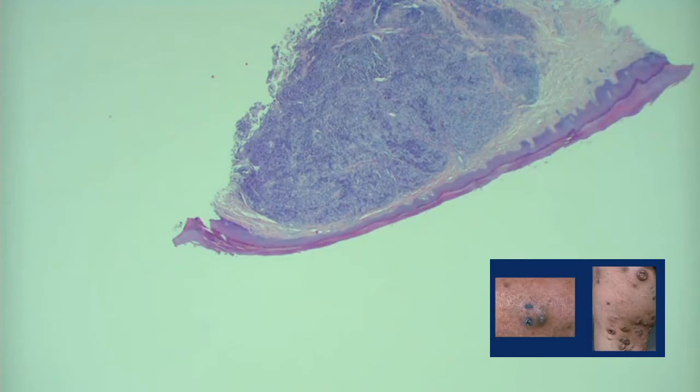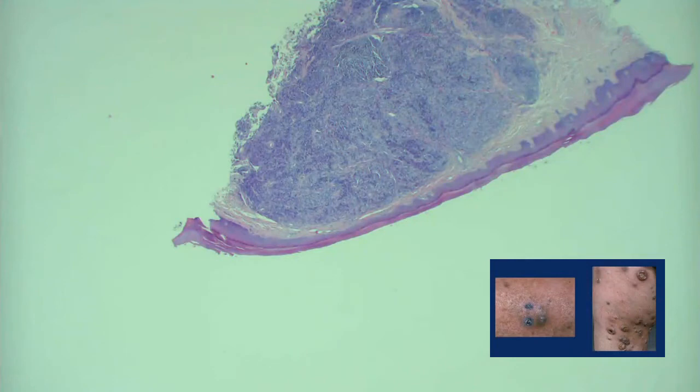The reason they look scary is because they're attenuated spread throughout the dermis. Not because they look like this. Okay. A nodular aggregation of atypical cells. So that's a different reason why it's still malignant. Here you see, usually metastatic lesions don't ulcerate as much, but they mostly are kind of dermal nodules. Anyway, so this is metastatic melanoma in the next line.